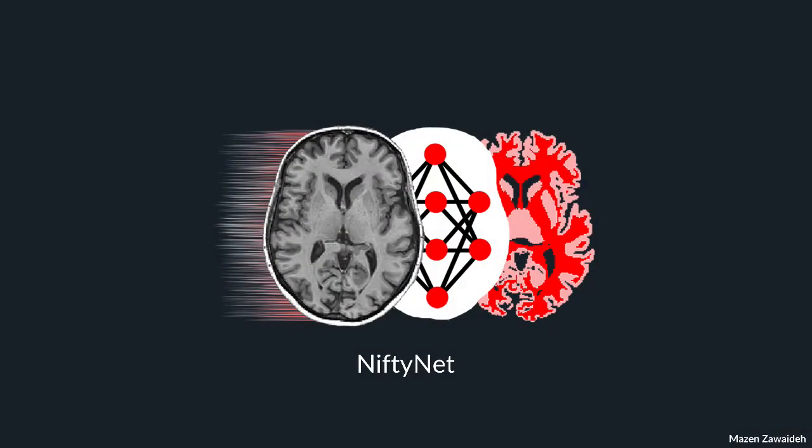So what exactly is NiftyNet? NiftyNet is a software framework which, loosely speaking, is a large library of reusable code modules that provide a particular function. In this case, functions that will be of use to us include data input and preprocessing, defining our deep learning network, generating meaningful network output, and evaluating the performance of our model. Such modules speed up our deep learning experiments, as we save a lot of time by not writing our own code and reinventing the wheel. For more advanced uses, we can extend the framework by writing custom code, but this is a topic for later discussion.